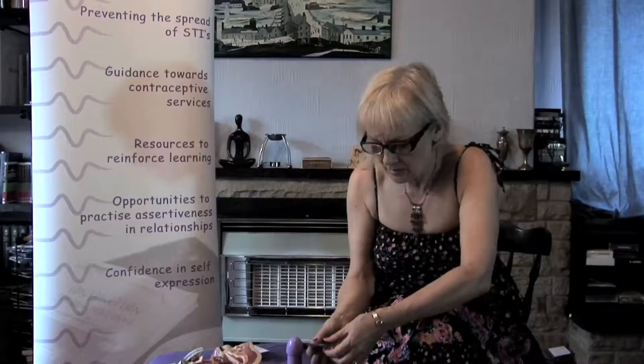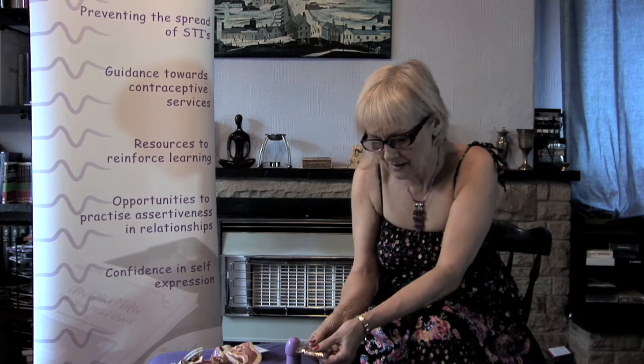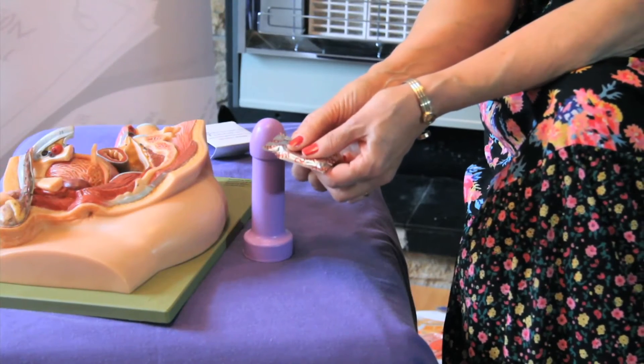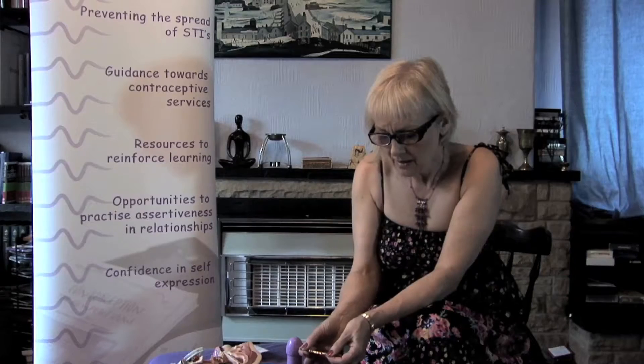The condom also needs to have been kept in really good condition, so we need to check the packet is still intact. If we squeeze the packet it should feel like a cushion with no air escaping. It's also useful to hold it up against the light to see if there are any holes in it, making sure nobody has tampered with it.